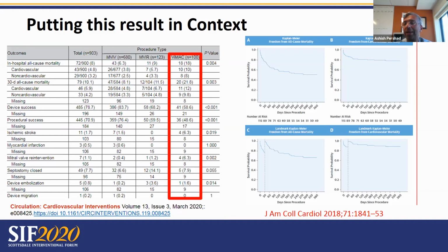Going back to the right panel, I'd like to focus on the 1-year results of our MITRAL 1 study, which looked at our valve and MAC patients, who were also followed all the way out. And this represents a sobering statistic that 50% of the patients are dead at 1 year, reflecting the severe morbidity that these patients have going into an operation like this. The majority of them have high STS scores and are non-surgical.